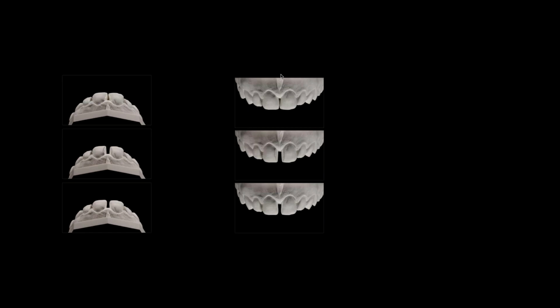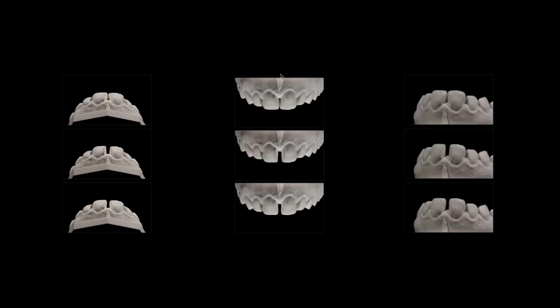And here in this case we close the diastema. The picture in the middle, sometimes I grind the model just to show my dentist what is necessary for me to do this work, how much space I need to have for these mini veneers.